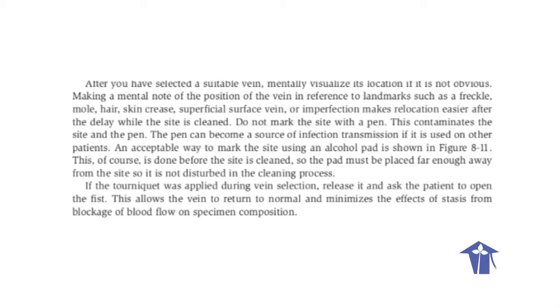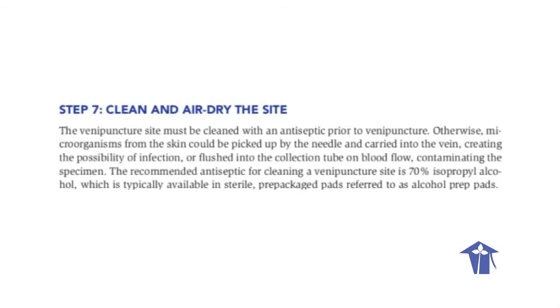If the tourniquet was applied during vein selection, release it and ask the patient to open the fist. This allows the vein to return to normal and minimizes the effects of stasis from blockage of blood flow on specimen composition. Step 7. Clean and air dry the site.